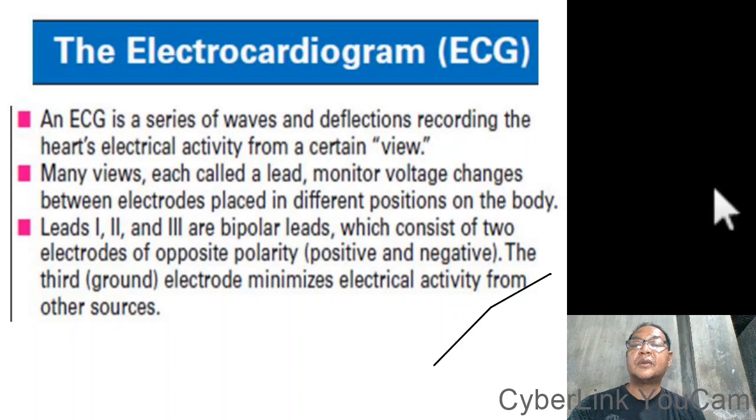Okay, let's continue. Let's talk now about the electrocardiogram, or the ECG. The ECG is a series of waves and deflections recording the heart's electrical activity of a certain view. Take note of this: of a certain view.